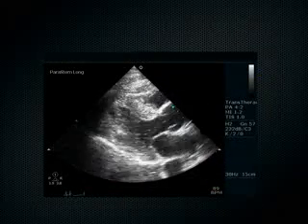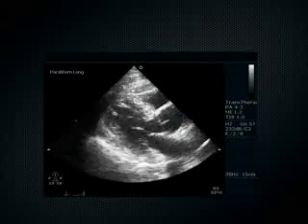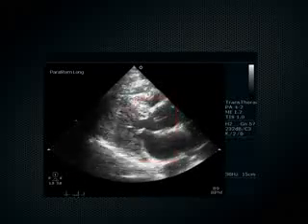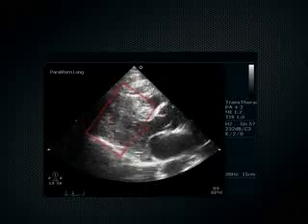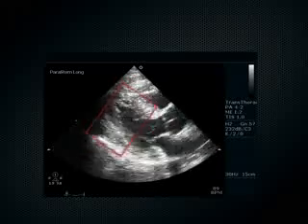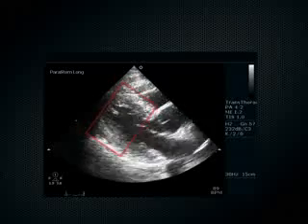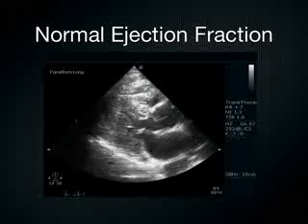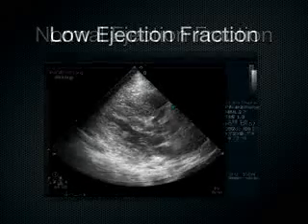How about this next one? Okay, septal leaflet coming up. Pretty good, hitting that septum pretty well. Okay, good sequentiality going on. How about the LV and the septum, interventricular septum? Yeah, the heart is emptying with each beat. See how they actually touch each other there. And when they touch each other like that, and this patient's blood pressure is 70, I know that I need to right away get some fluids going, right? This is a dry heart. It needs some fluids. A normal EF that's a very thirsty heart.